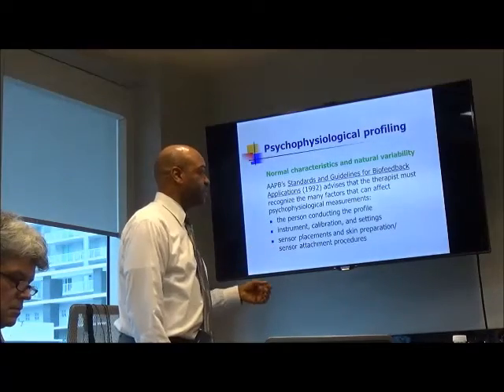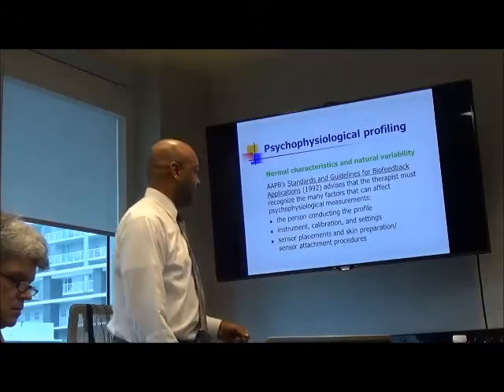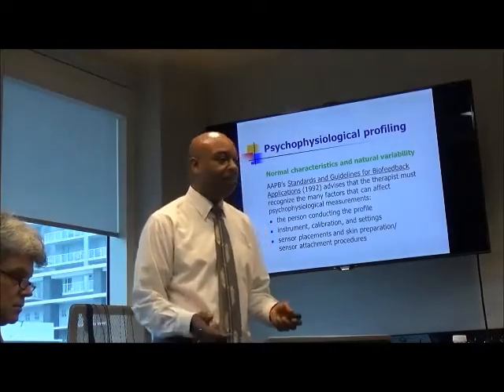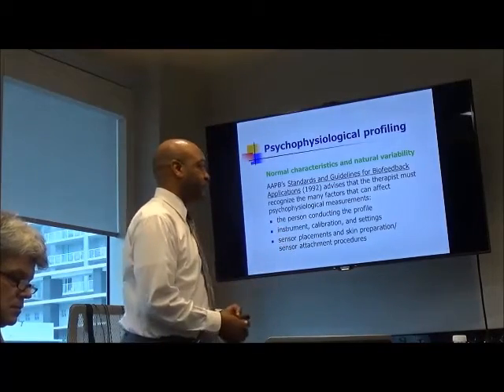The sensor placements, and as Dr. Palacios mentioned, the skin preparation is very important, and how you attach the sensors. All of those things are very important, and differences in that can affect your results, so you want to be careful.